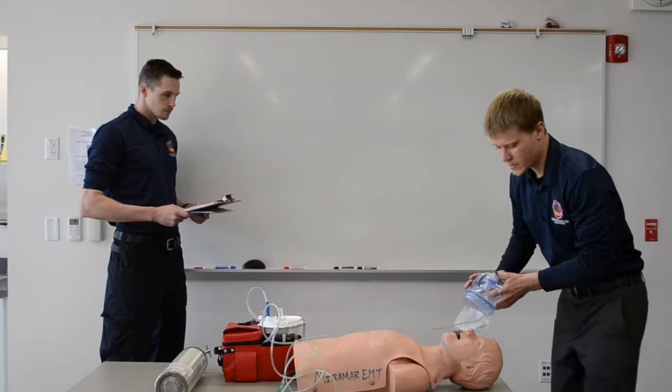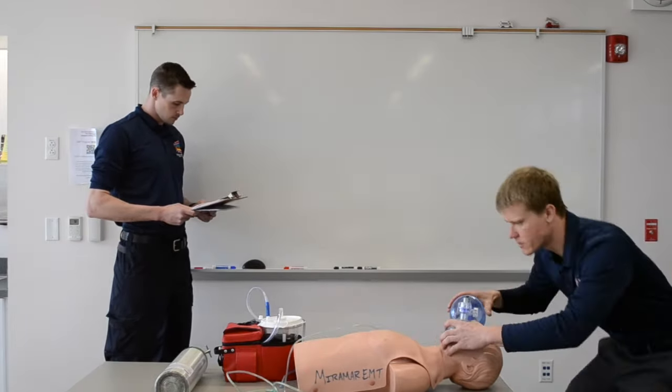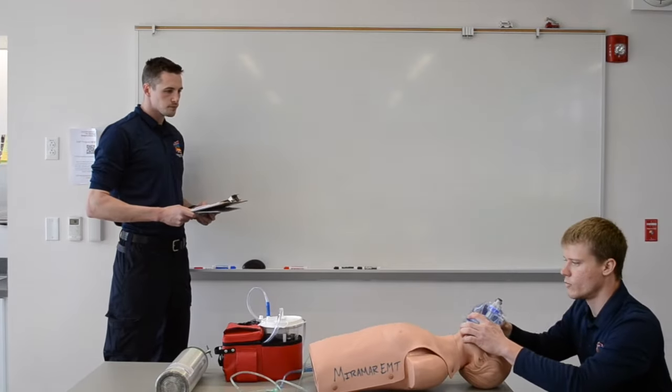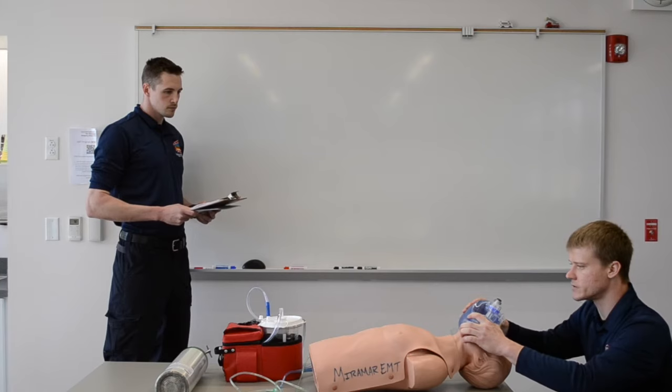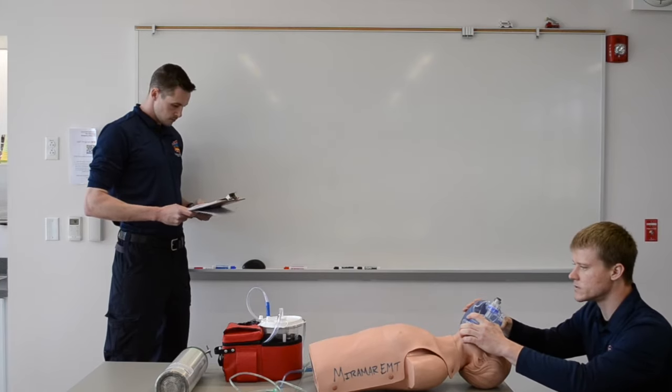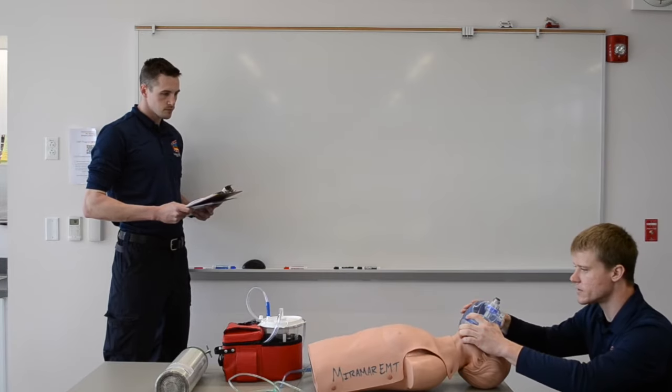We'll grab our BVM and start ventilations on room air — bridge of the nose, cleft to the chin, CE grip. One-one-thousand, two-one-thousand, three-one-thousand, four-one-thousand, five-one-thousand. Ventilation is being properly performed, delivering multiple breath cycles.